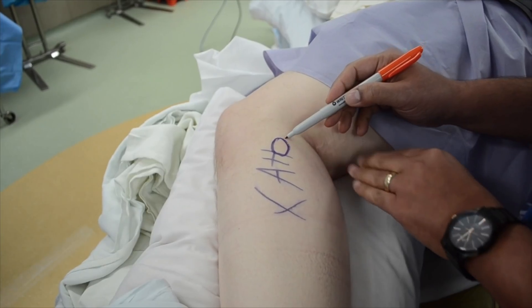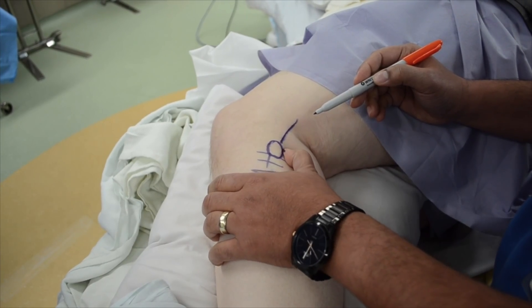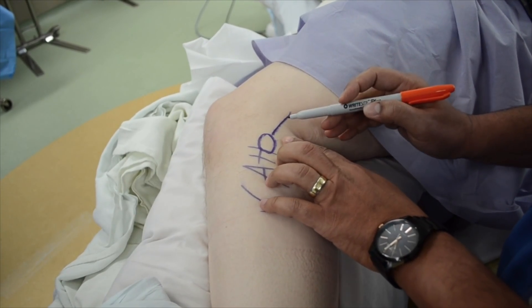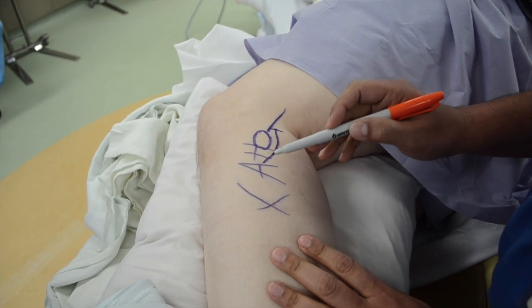The common peroneal nerve, also known as the common fibular nerve, lies posterior to the fibular head and lateral to the fibular neck. A 4-5 cm curvilinear incision, posterior to the fibular head and lateral to the fibular neck, will provide adequate access to the nerve.